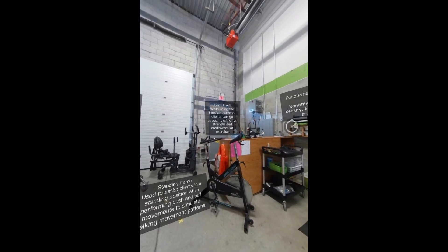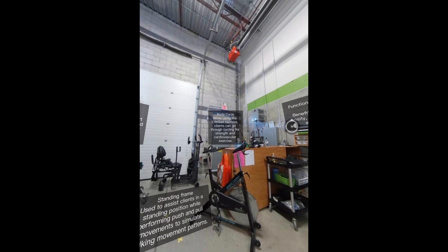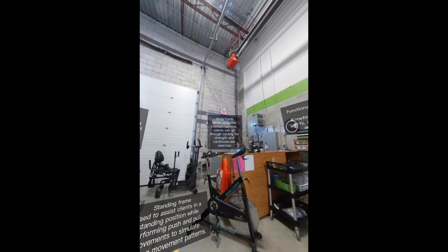The Body Cycle: while clients are harnessed to the light gait, they are able to go through cycling for strength and cardiovascular exercise.